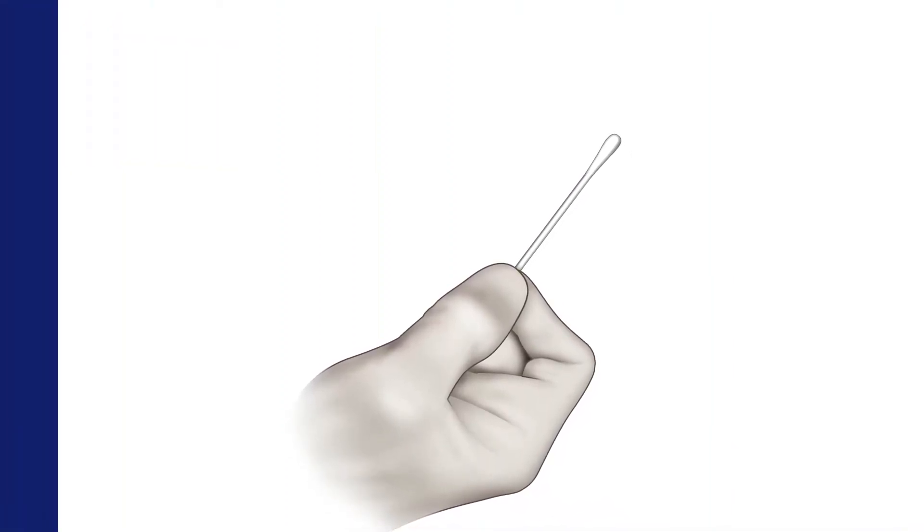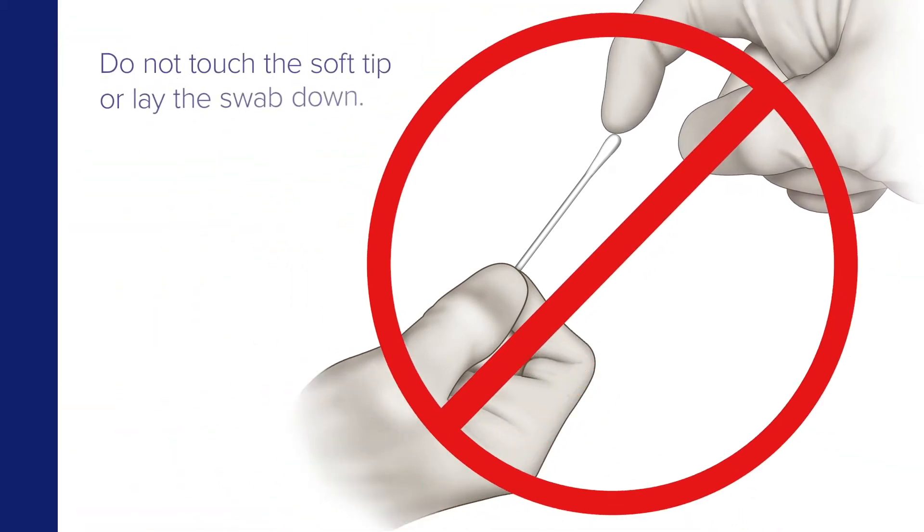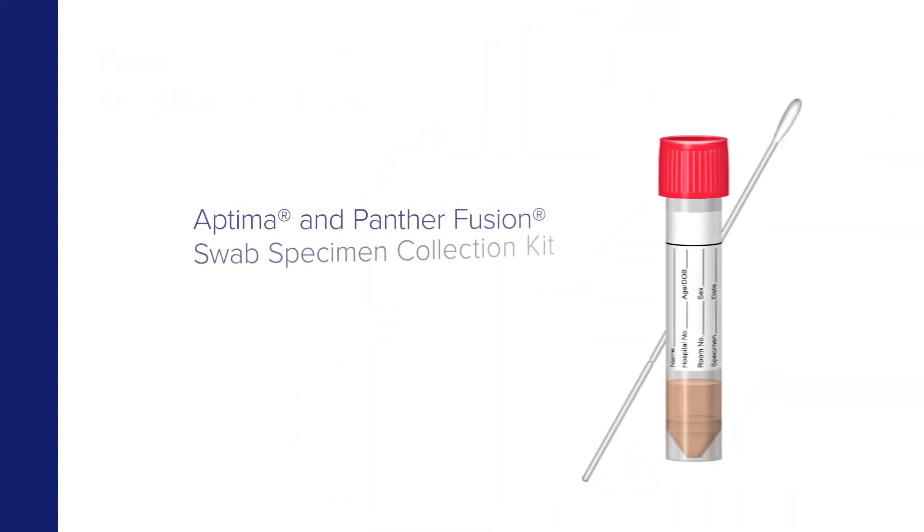Begin by removing the swab from the package. To avoid contamination, do not touch the soft tip or lay the swab on a surface. If the soft tip is touched, laid down, or dropped, discard it and get a new swab collection kit.